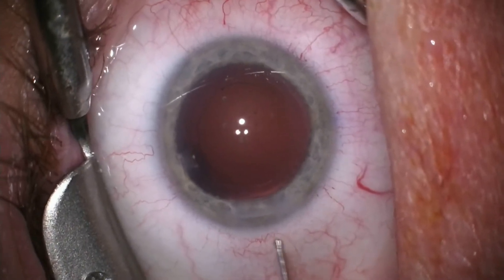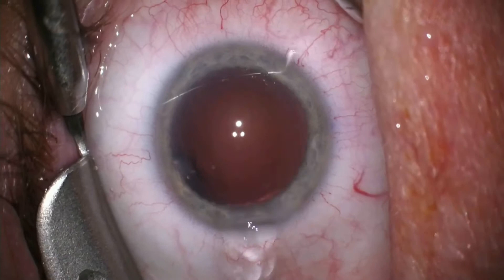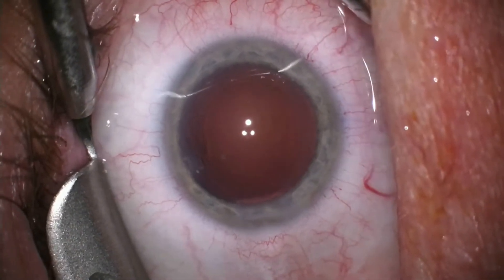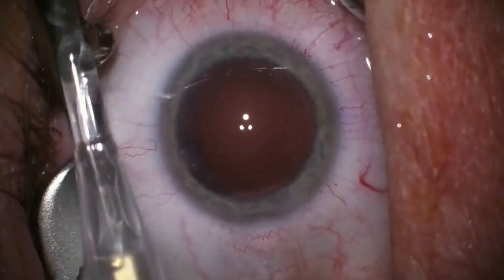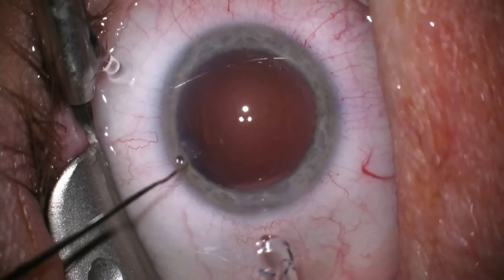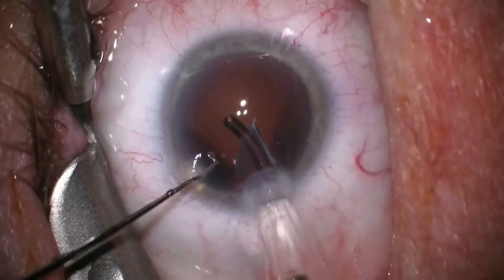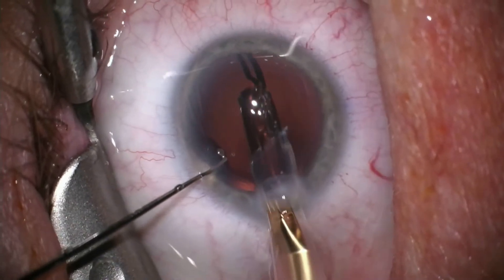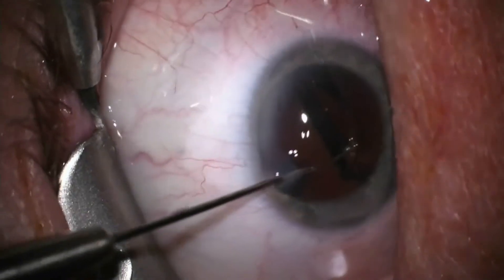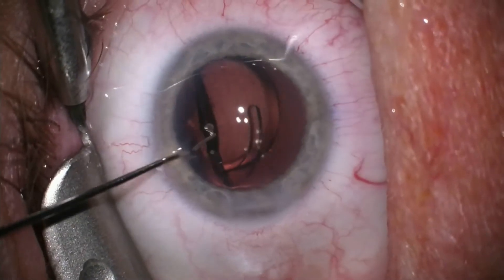I am inserting gel to reopen the capsular bag. In a moment we can take a look at the Symfony toric lens within the injector, and we will then insert it through our small incision. It unfolds slowly within the empty capsular sac. If you look closely you can see the peripheral rings etched into the Symfony implant, which makes it the only lens of its kind to provide an extended range of vision.